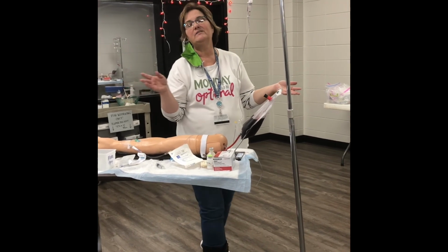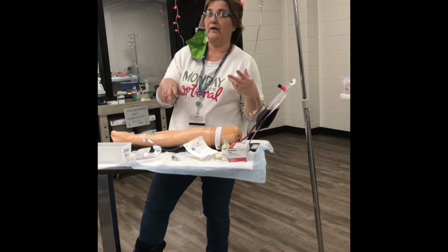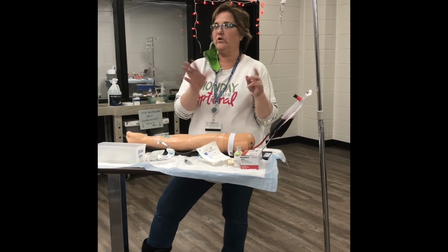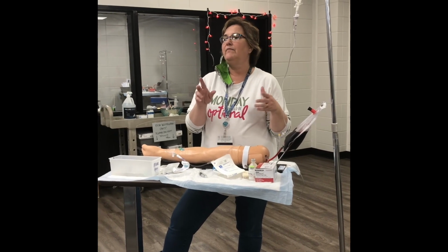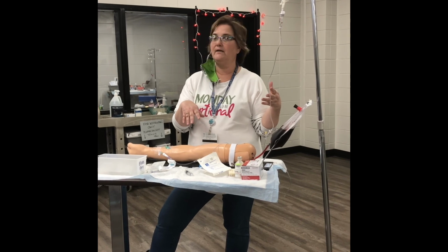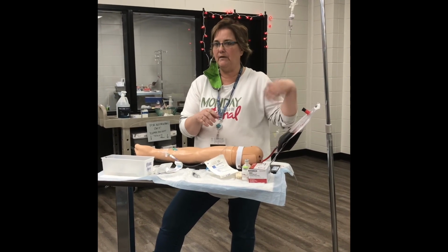All right, so take your drip rate, divide it by 4. A minute divided by 4 is 15 seconds. So whatever you get divided by 4, you get that in 15 seconds. Then once you've got that correct, you count it for a full minute and make sure you have it right. The only reason we do that is to speed up the process.